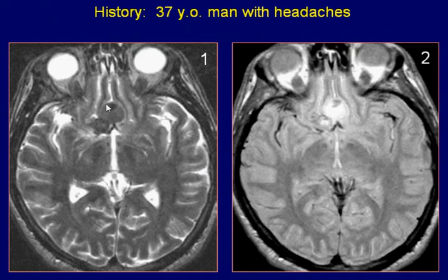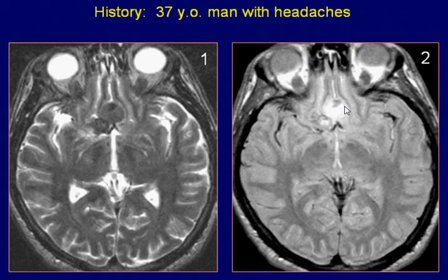The images demonstrate a well-defined, slightly heterogeneous lesion situated anterior to the third ventricle. The lesion is low signal on T2 and high signal on proton density images.